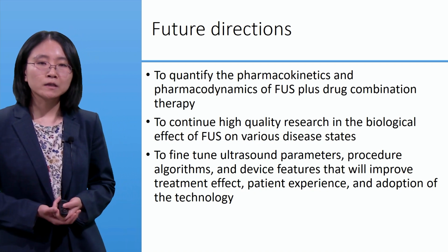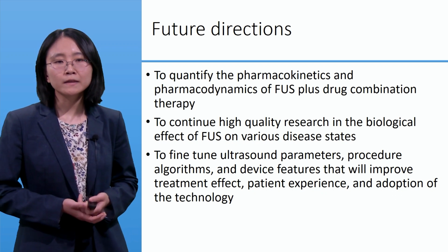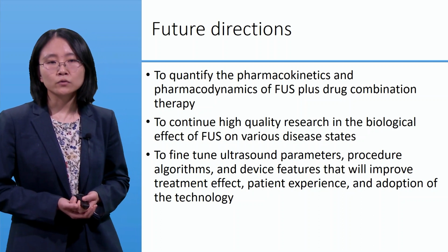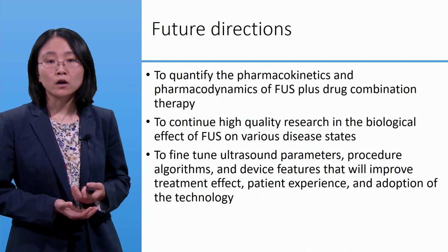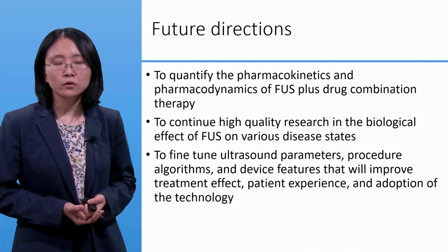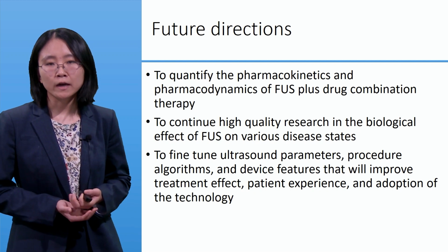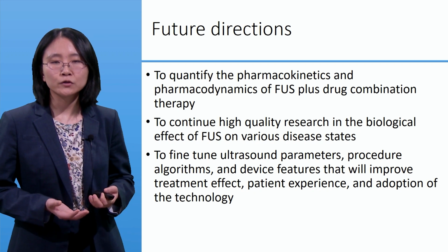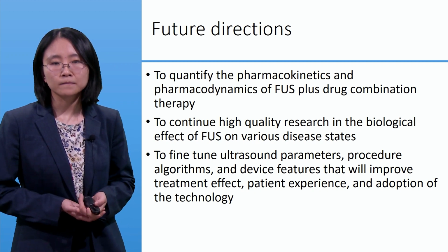One instance of this could be the efforts made in the hemispheric array device to forego the placement of a stereotactic frame, which is often hard for patients to undergo, and also to forego the fact that a hair shave needs to be performed. These are all various efforts to improve the patient experience and eventual adoption of the technology, should it be shown to be effective.